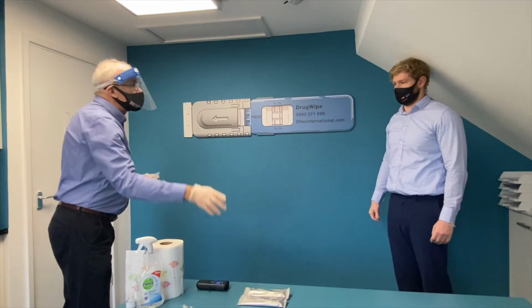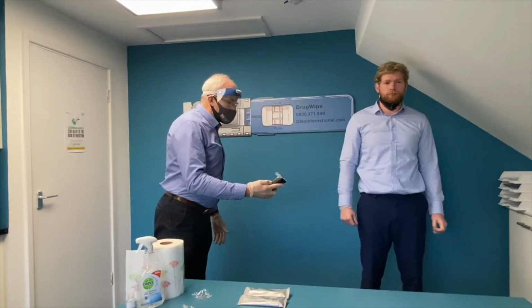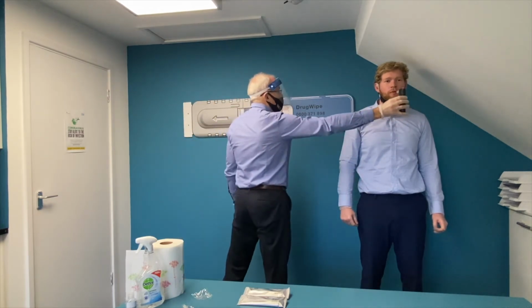When conducting the alcohol screen, please follow previous guidance as well as ensuring never to stand directly behind the open end of the tube whilst the employee is blowing.